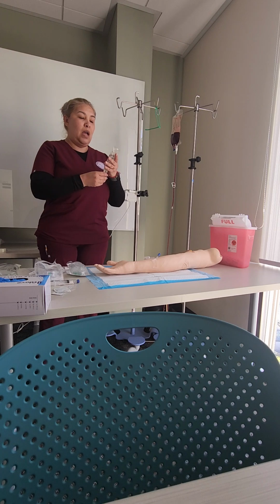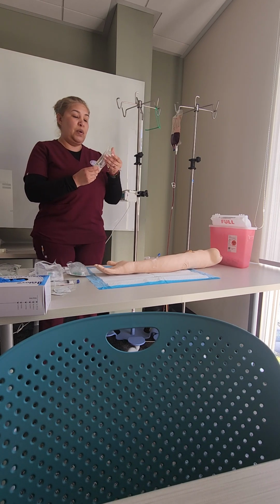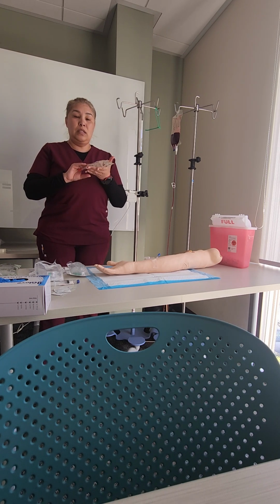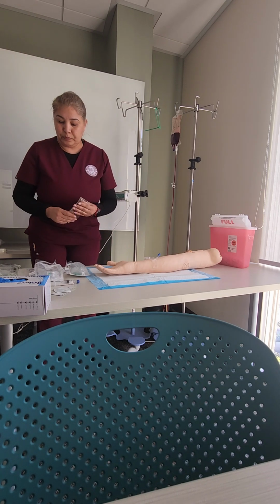I want to check my antibiotics that my patient will be receiving. I want to check the bag, that it's the right consistency of the medication, that the bag is not compromised, that it's not expired, and that, first of all, it is the right medication for my patient.